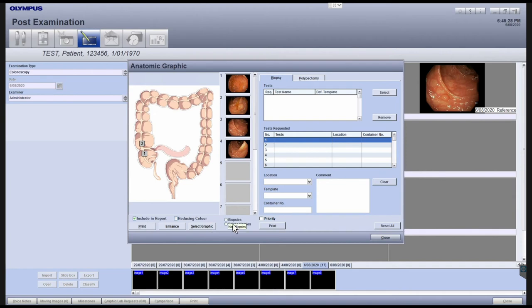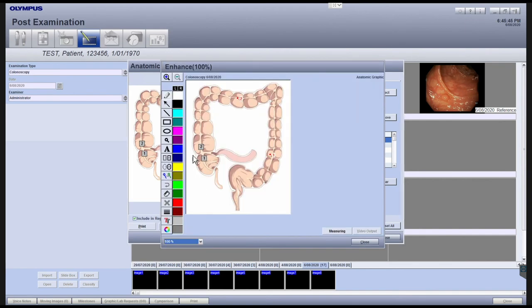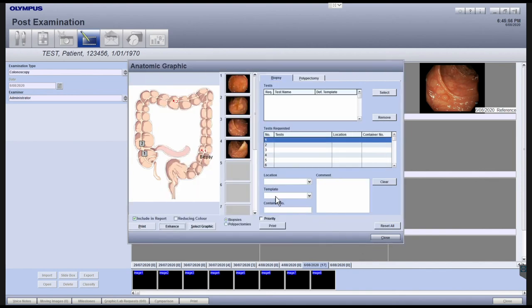To add locations of biopsies or polypectomies, click the appropriate checkbox and then mark where the biopsy or polypectomy was performed. You can also enhance the anatomical graphic by clicking the Enhance button. After the anatomical graphic has been selected and marked up, click the Close button to return to the post-examination module.